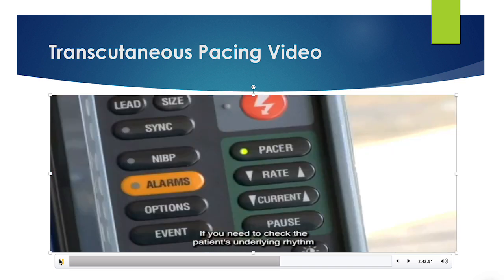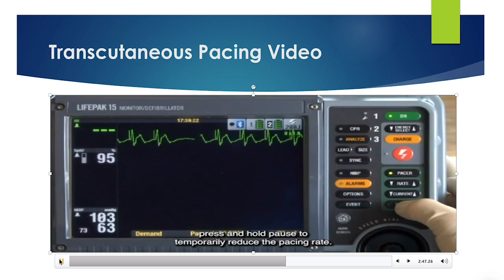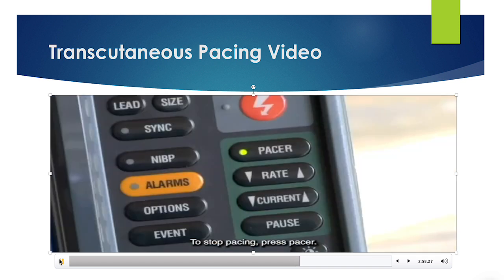If you need to check the patient's underlying rhythm, press and hold pause to temporarily reduce the pacing rate. Release the button to resume pacing at the set rate. To stop pacing, press pacer.